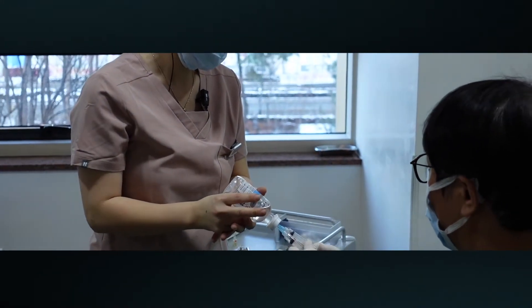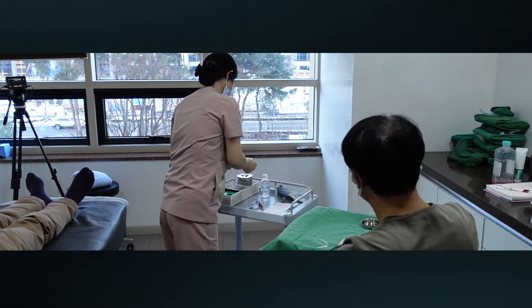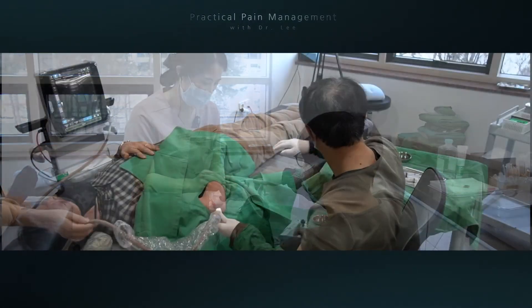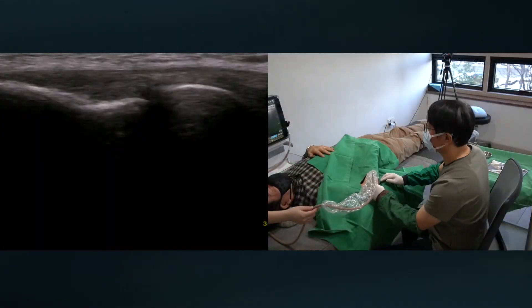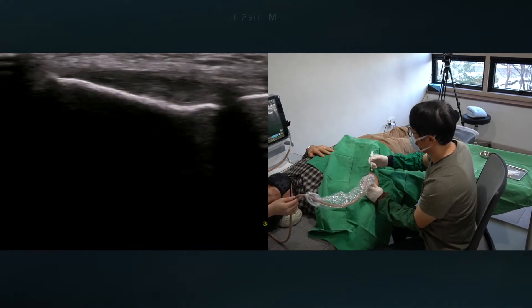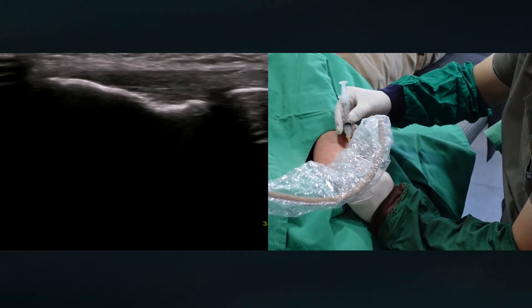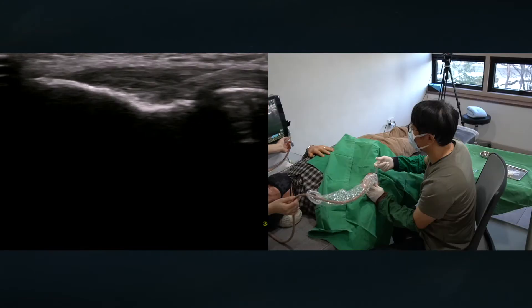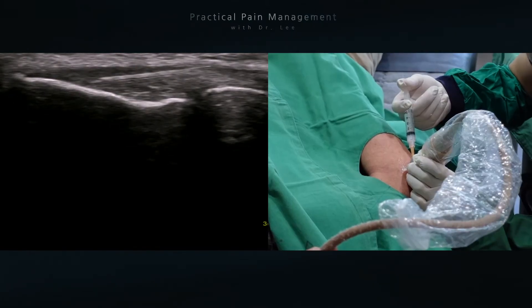I draw the hypertonic solution into two different syringes. First, I'm going to inject it into the common extensor tendon.